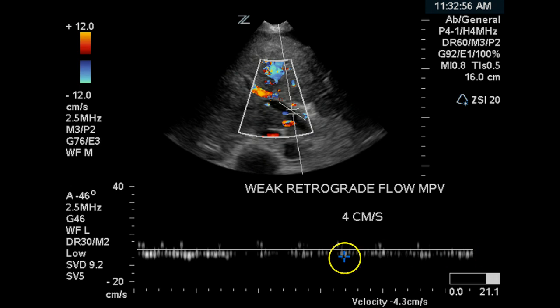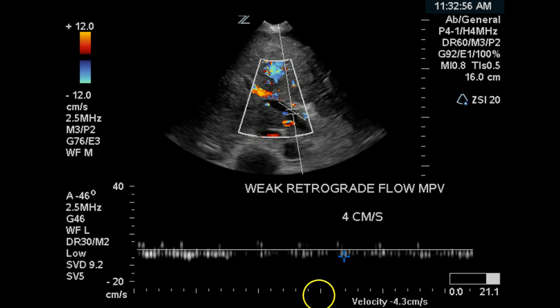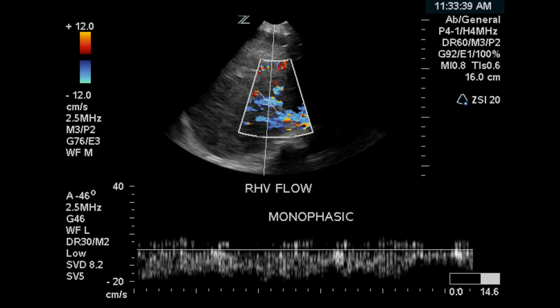This image demonstrates that there is a slight amount of blood flow within the main portal vein, but it is hepatofugal and is a very low velocity flowing out of the liver.